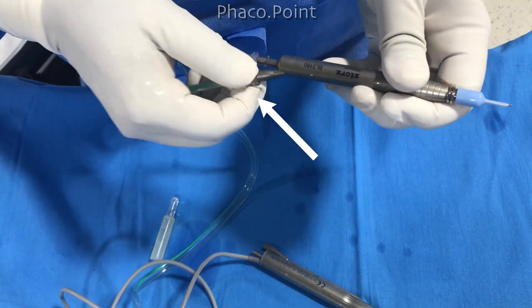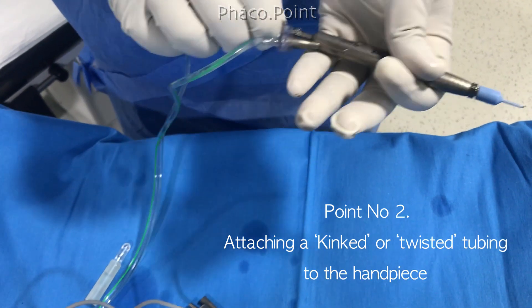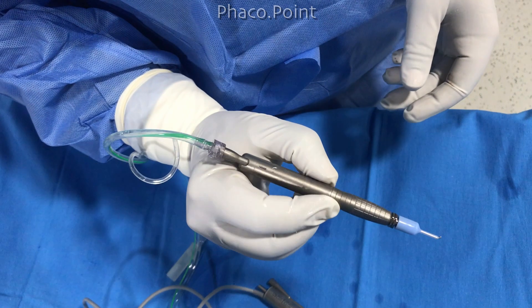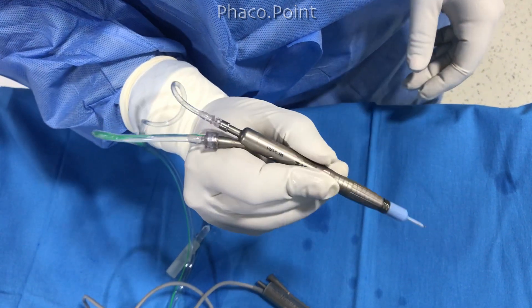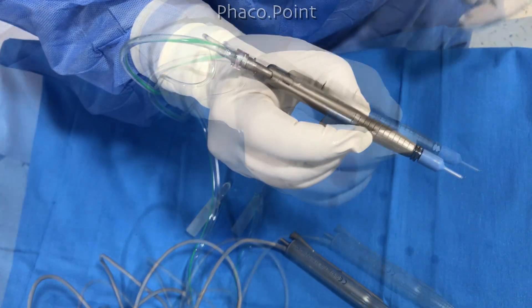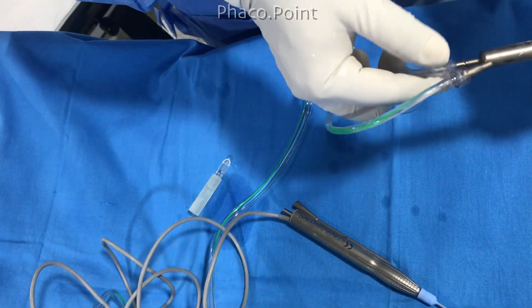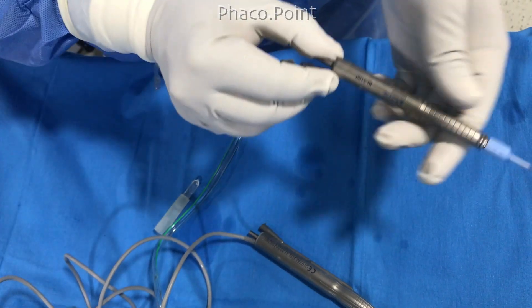This is the irrigation line and the tubing, and you will notice that while connecting the aspiration line I have not bothered to remove the kinks from the tubing. That is why when I relax my grip there is an auto-rotation of the coaxial IA. This is going to create a lot of problems when I try to maneuver the probe within the eye. The most important thing is to first notice and remove all the kinks and abnormal twisting from the tubing.